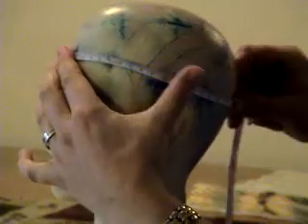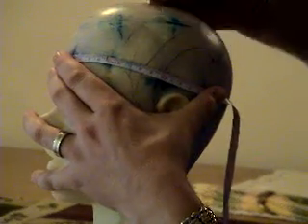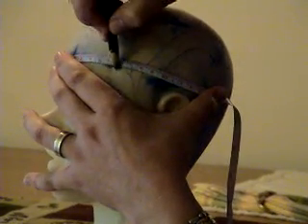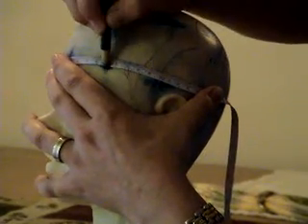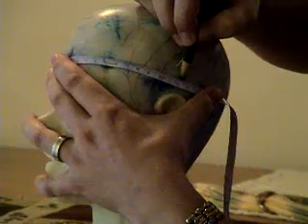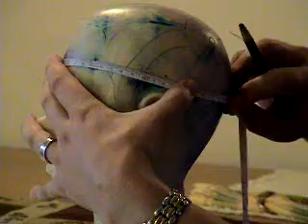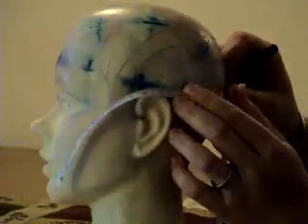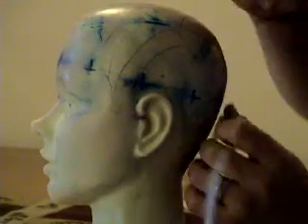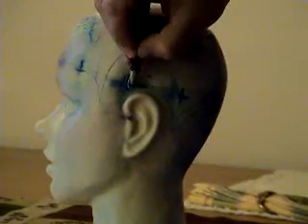And what you can do in order to make sure that your lines are accurate and straight is you can take the tape measure and place it halfway around the head, or as far as your hands will reach. Make a line just below the tape or just above. The key is to be consistent. Don't go below the tape here and above the tape here. Keep it the same. Below the tape, below the tape. And what you're doing is you're crossing those lines that you've just drawn, just like so. Now you end up with your XY axis.